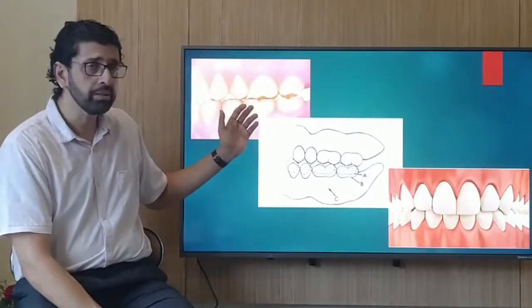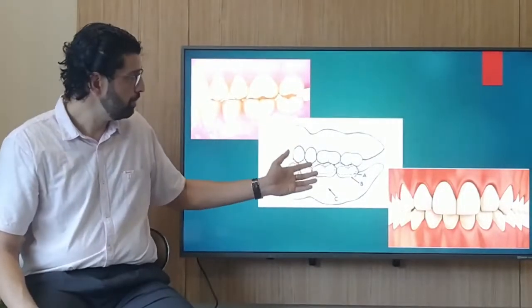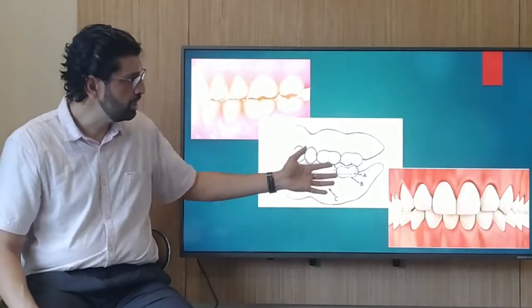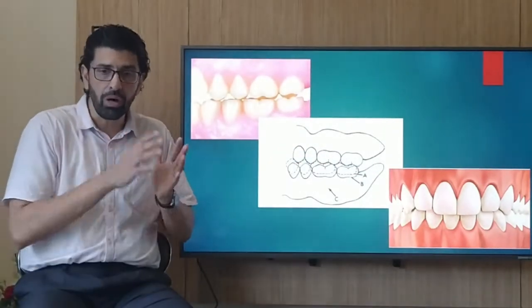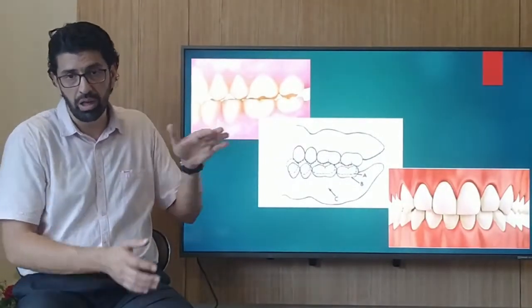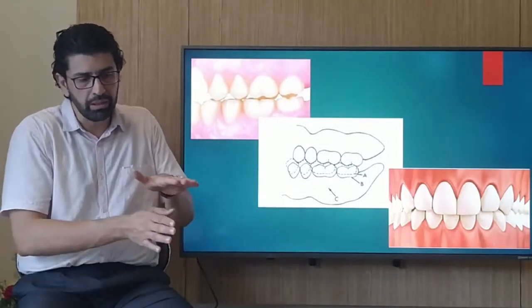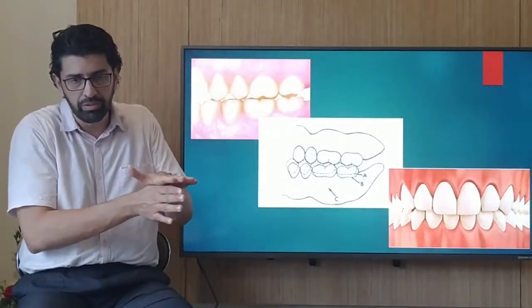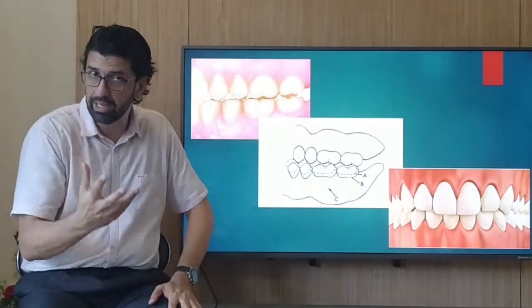Okay? If there's a space continuously, obviously you've got serious errors in occlusion. Or there's a sliding in coming into occlusion, or finally there's a lateral shift. So, any one of these. Errors in mounting can prevent some teeth from intercusping after first contact is made. So you need to really get the patient to stop at first contact and then ask him to bite, and then see how it is, whether it's sliding or not.